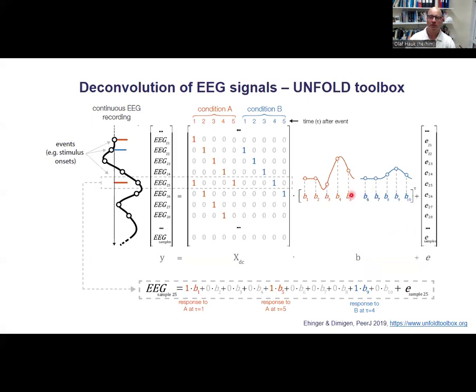And then for these different betas in your model, you get something that looks very much like an evoked response. In fact, it's comparable to a difference response in the factorial design. Let's say you have long and short words in the factorial design, you compute the subtraction. What you get there is comparable to what you would get for the regressor word length in a model like that. So you can interpret these results from these regression approaches a bit like evoked responses, but difference responses.